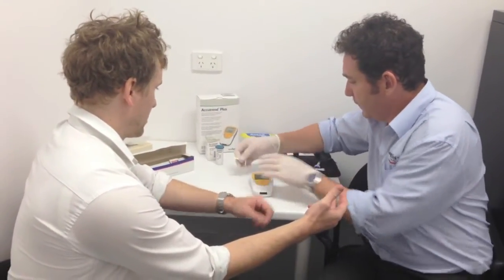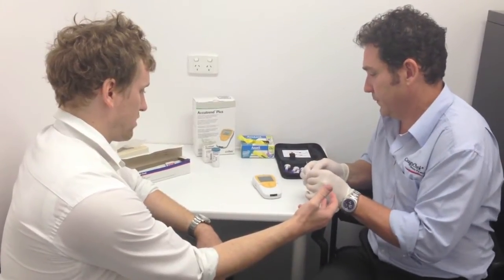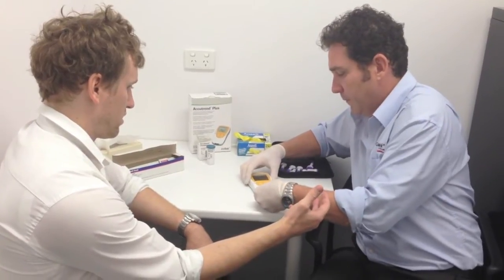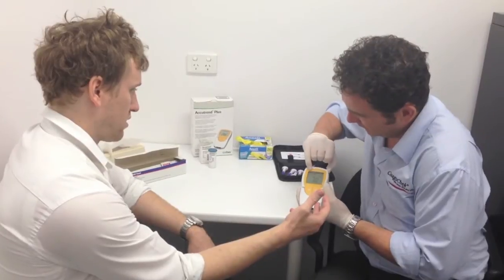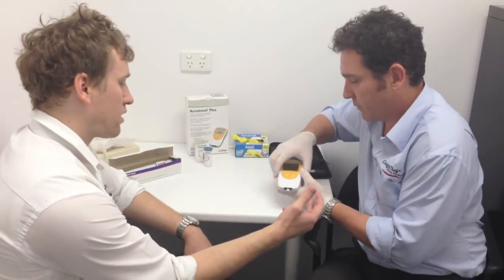So we've got the strip and we turn on the instrument. The instrument is ready to go — we can see at the top of the screen it's indicating to lift the lid, so we know that it's ready to go.